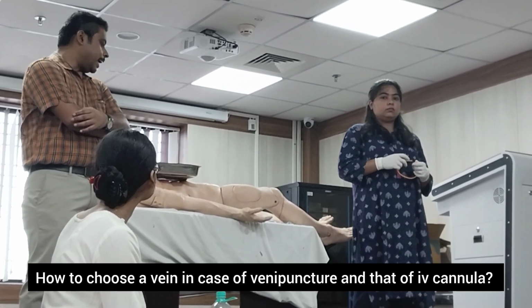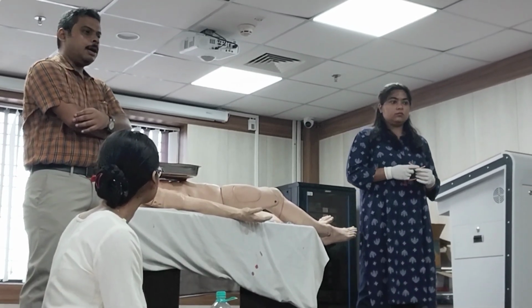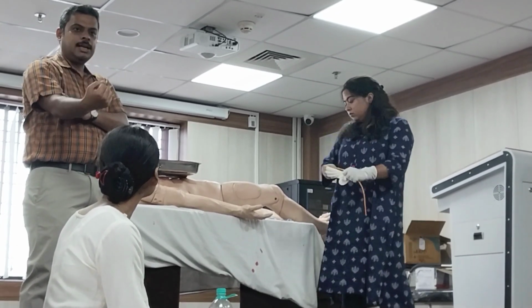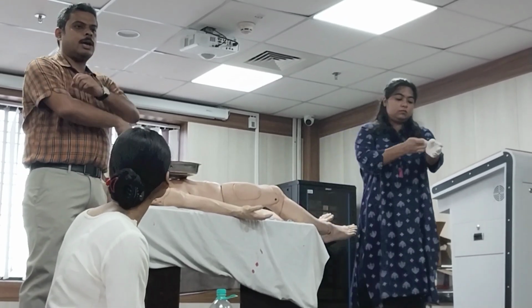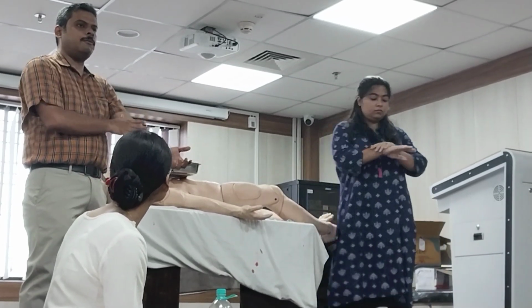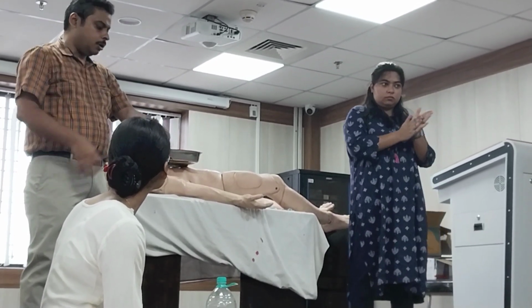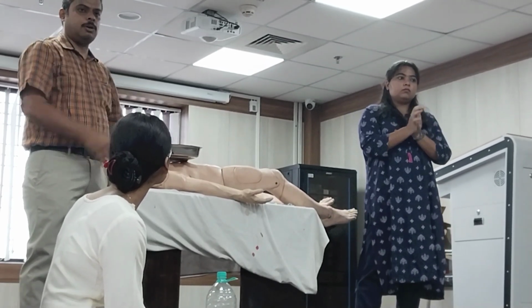choose. As madam had told you, in venipuncture we usually choose the antecubital vein, but when we are going in for IV cannulation, we usually avoid the joints because the patient will move his hand. The IV cannula will be there for a long time, and if the patient moves the joints, the cannula will be destroyed. So we will have to choose a long segment of vein. We usually choose the anterior aspect of the forearm, or the dorsum of our hand, where we get a long segment of vein.